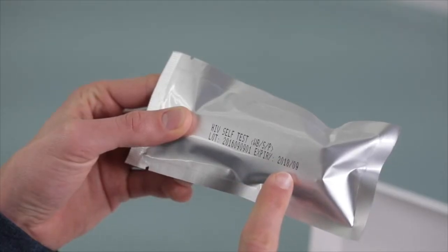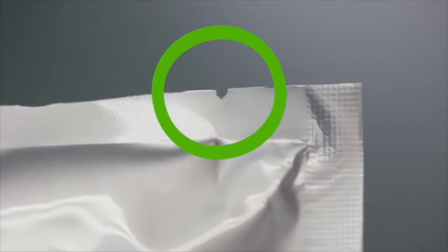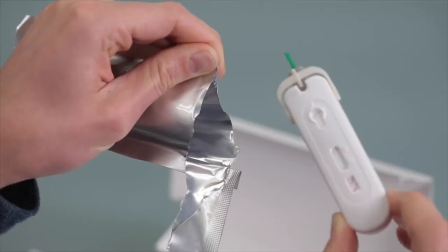Before you open the foil pouch, check the expiry date to make sure it is still current. Open the foil pouch using the tear notch and take out the test. Don't use the test if the foil pouch is damaged.